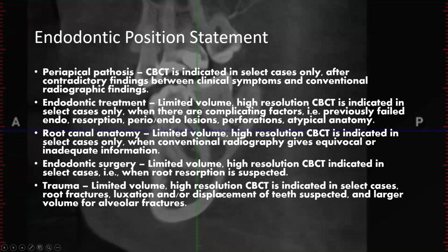All right, trauma. It's indicated in selected cases if you suspect root fracture, or if there's luxation or displacement of teeth. Use a larger field of view if you suspect alveolar fracture.